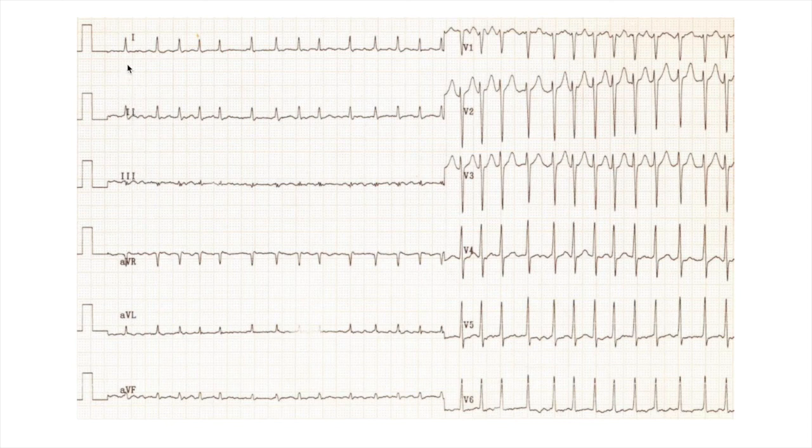Look for P waves. There are no P waves. So no P waves, irregularly irregular, thinking AF. You can also go on and say QRS, not too broad, it's fine. T waves, cannot actually picture any T waves. There might be some, you can convince yourself. And, oh yeah, almost forgot, axis deviation. So this actually looks almost isoelectric. So we're bordering on left axis, but I would say normal. So yeah, in summary, this is atrial fibrillation.